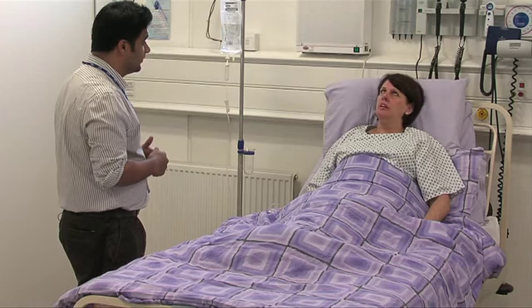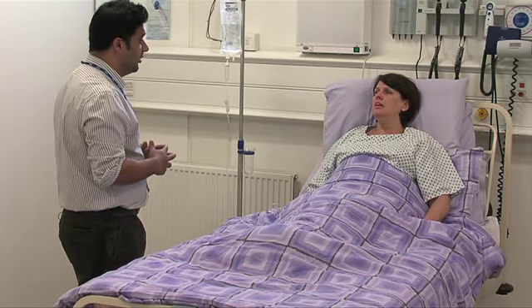Because I've been having all these flus, and my bladder feels it's up to there. You've had an operation. Yeah. That's one of the complications of having difficulty in peeing after an operation. Oh, right, okay. Like I said, it's slightly uncomfortable. We give you a slight clean around the water pipe, insert the urinary catheter in, and hopefully the pain will ease off after that. Oh, I hope so. Would that be okay if we proceed? Yeah, that's fine. Okay. Thanks. What I'll do, I'll get everything set up on the trolley. Okay. Then I'll come back through. Will you be long? No, it won't be long at all. Oh, great. And we'll take it from there.